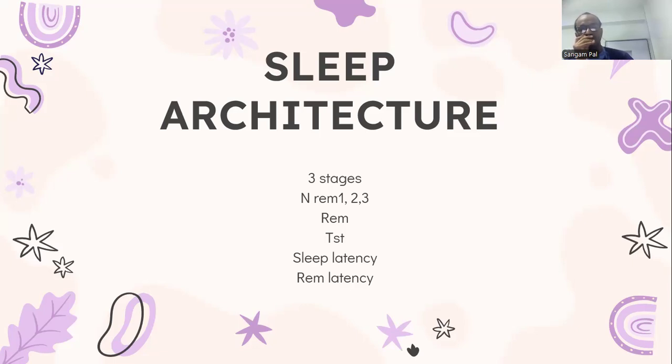In a sleep study, as we go deeper into sleep from stage 2 to stage 3, muscles relax and the obstruction increases. When there is increased obstruction, arousal occurs and the patient again goes into stage 1. Again he falls asleep and goes into deeper stage 3 or REM, and there is obstruction, apnea or hypopnea, and the person wakes up and again goes into stage 1. So in an obstructive sleep apnea patient, there is less deep sleep and even less REM.